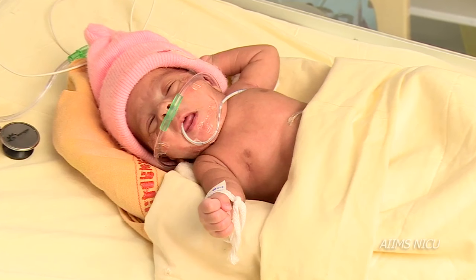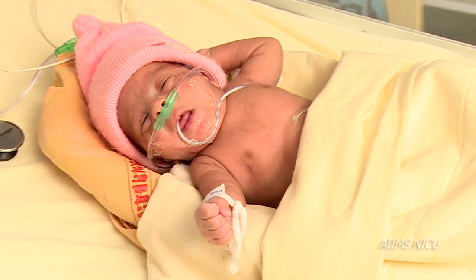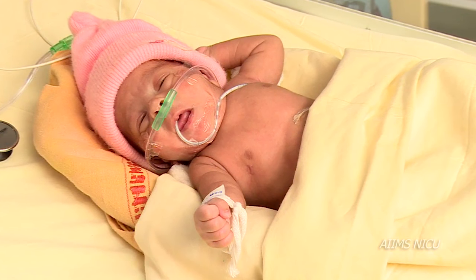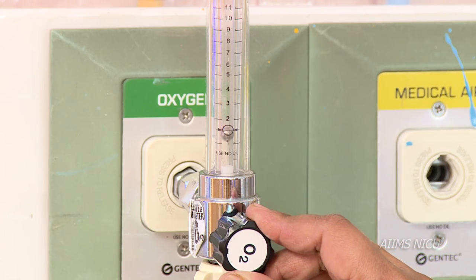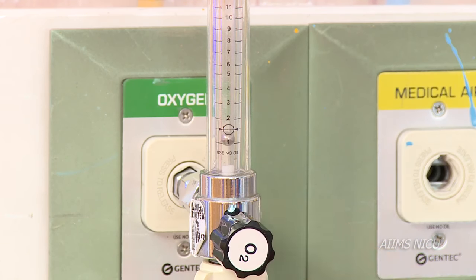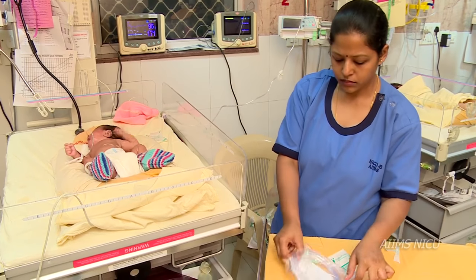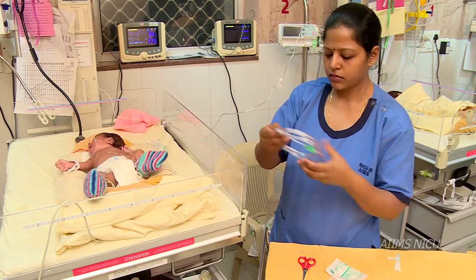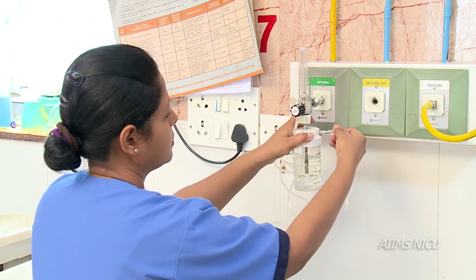Now we shall learn administration of oxygen by nasal cannula or nasal prongs. Remember to keep the oxygen flow rate between 0.5 to 1 liter per minute while using nasal cannula. Choose a cannula of infant size and always use a new cannula. Attach the end of the nasal cannula to the flow meter.